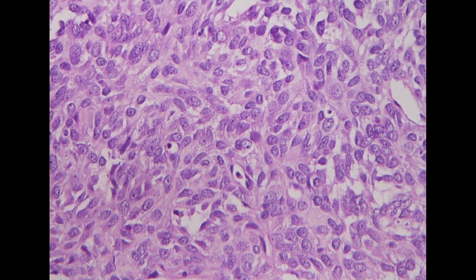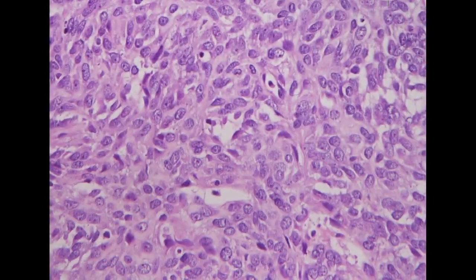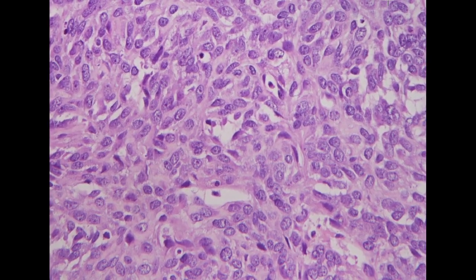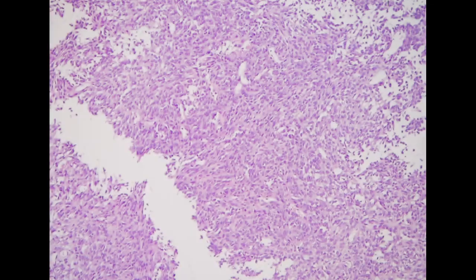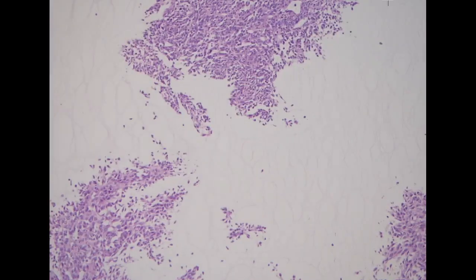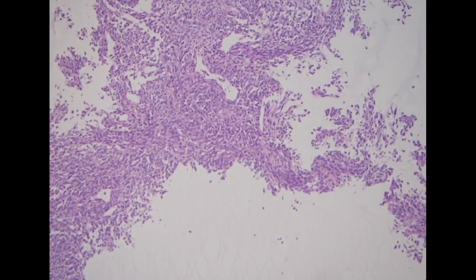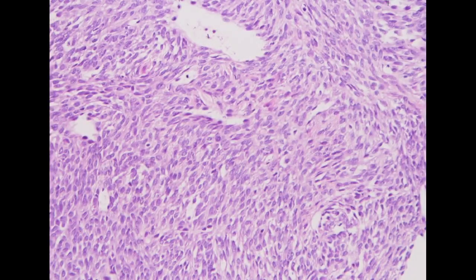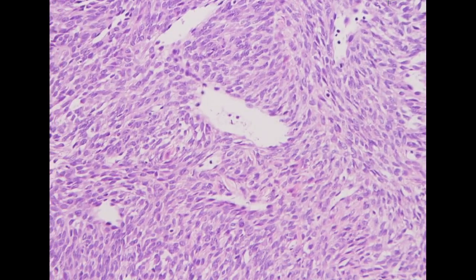It is mostly oval to short spindle and arranged in, I would say, a patternless pattern, because it's going everywhere. It is highly cellular. Sometimes for synovial sarcoma, it can also show a staghorn type of vessel pattern. So you do see some dilated, thin-walled branching vessels. But it is not like the solitary fibrous tumor that has a more collagenous background. It is very, very cellular.